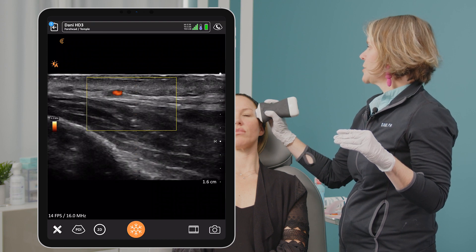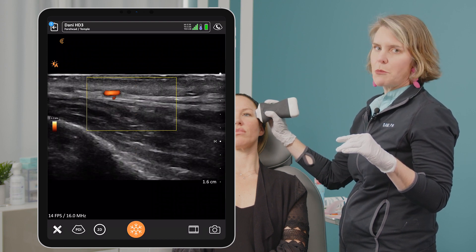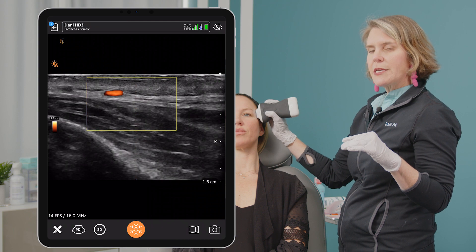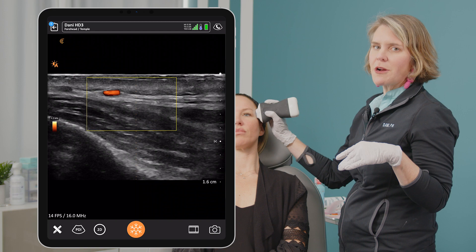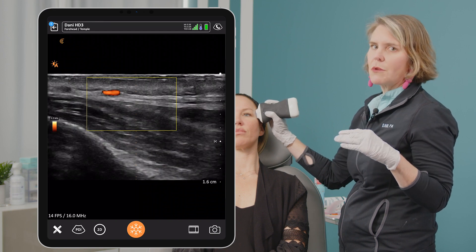I'm showing you on the screen — we're in Doppler mode. Remember when we're using a cannula we like to be on B-mode, because we don't want to see all that reverberation artifact when we put a cannula in on Doppler.